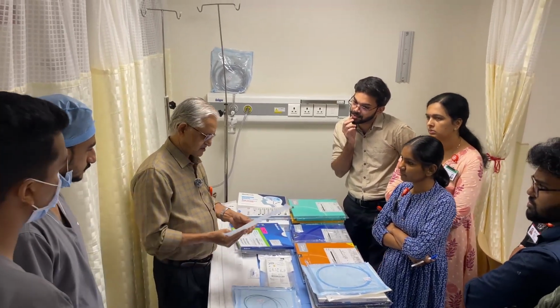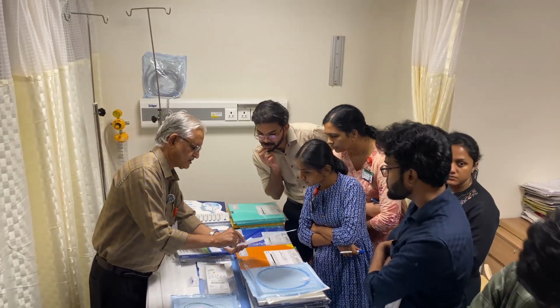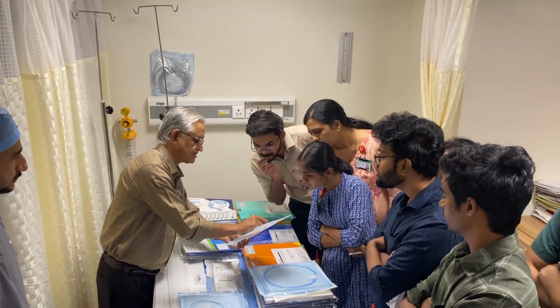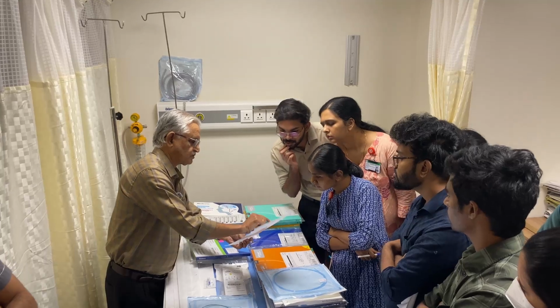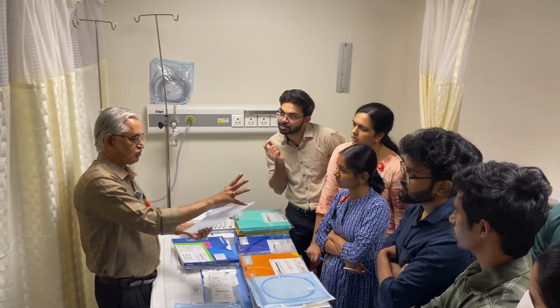This is the microcatheter. Inside the microcatheter there is a sheath, and inside this is where the stent retriever sits. So this has to go through the microcatheter and go into the normal artery beyond and then open up.